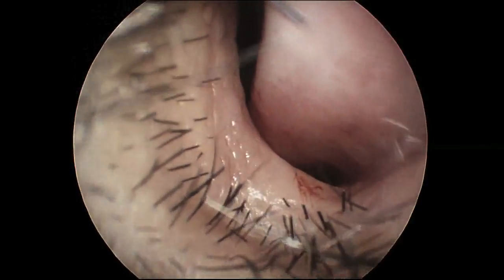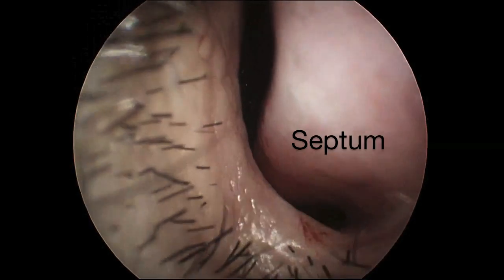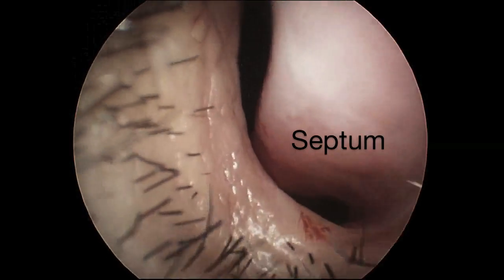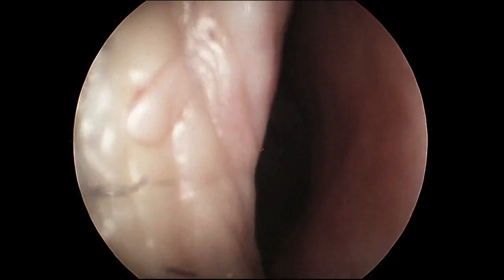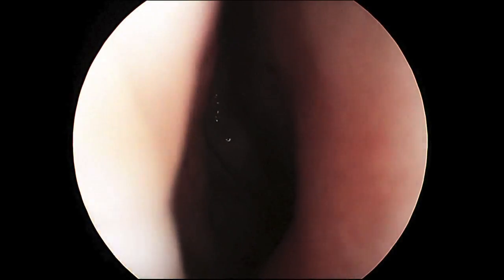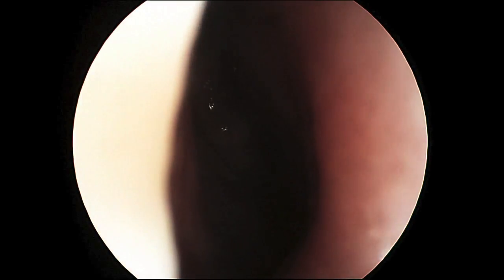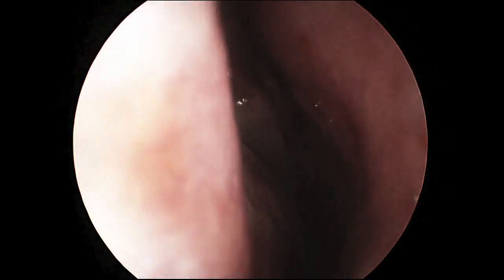Now we're entering the right nasal cavity, and you can see the deviated septum immediately, and it's blocking nearly all of the airway on this side. And that's from the cartilage that slipped off of the maxillary crest, which is part of the upper jaw bone in that area.